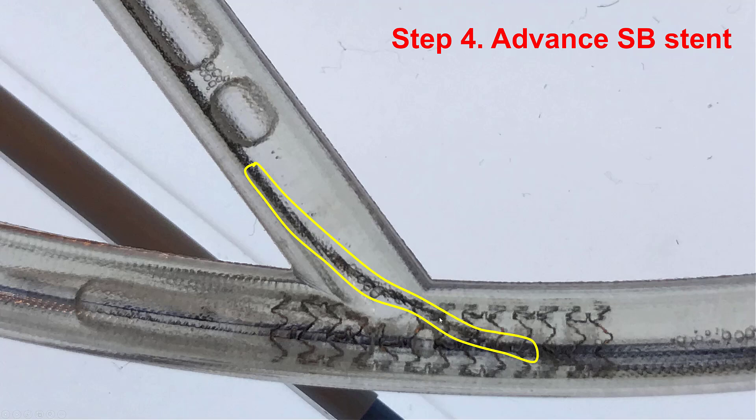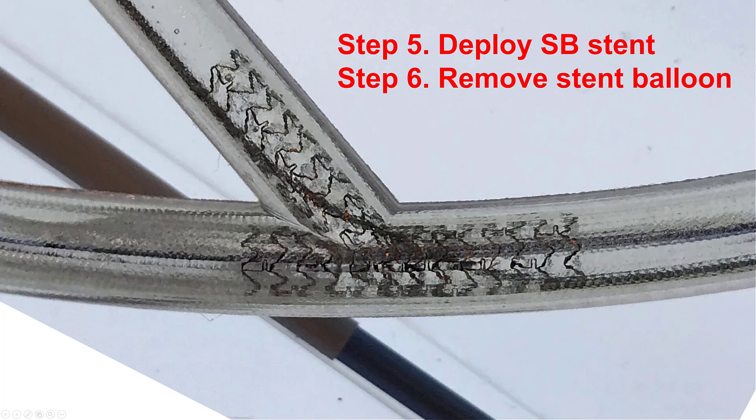You don't want a very short protrusion of one to two millimeters, because if you miss the ostium then you may need to place another stent, and this is a problem. The reason for advancing the main vessel balloon first is because once the stent is deployed, there is a possibility of impinging into the main vessel, making delivery of another balloon very difficult or impossible. The next step is to deploy the stent into the side branch, which essentially means there is stent protruding back into the main vessel, and then the stent balloon is removed.